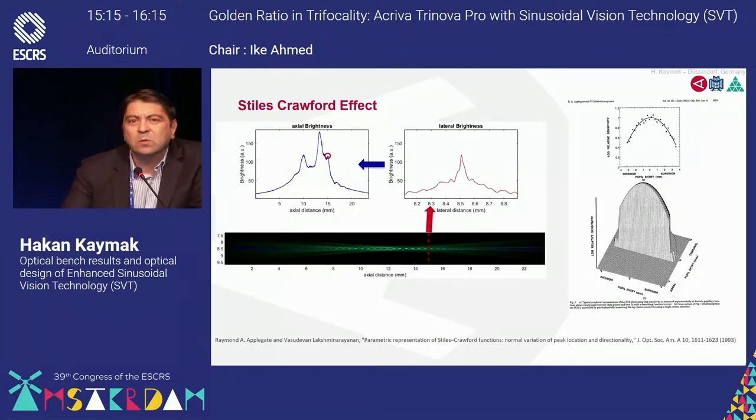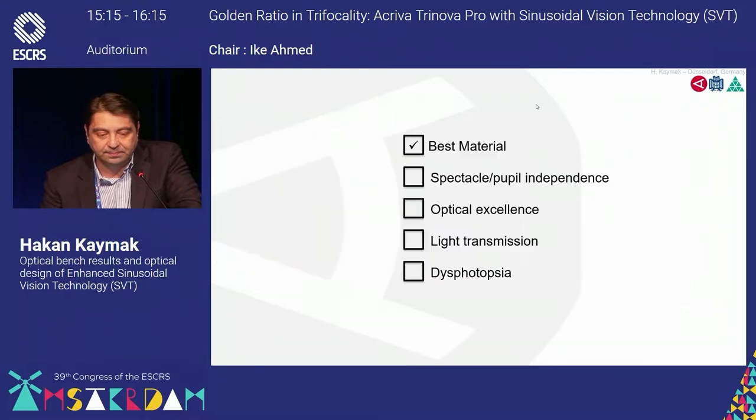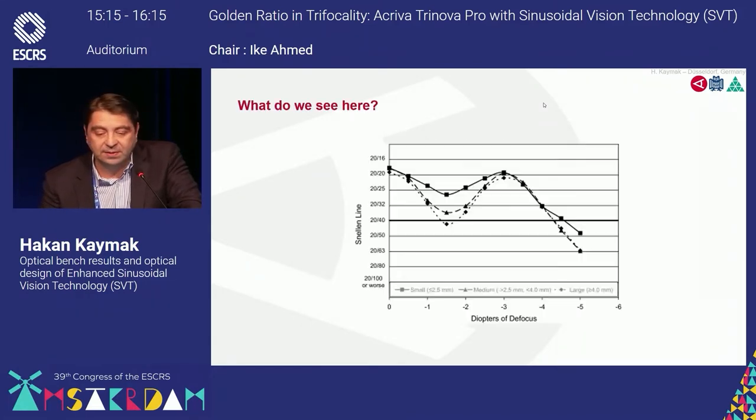The next thing we have to know is that the Stiles-Crawford effect also helps the patients to see better with these multifocal intraocular lenses. This was shown some years ago by Applegate in his patients. What about spectacle independence? We don't have to forget the pupil independence.